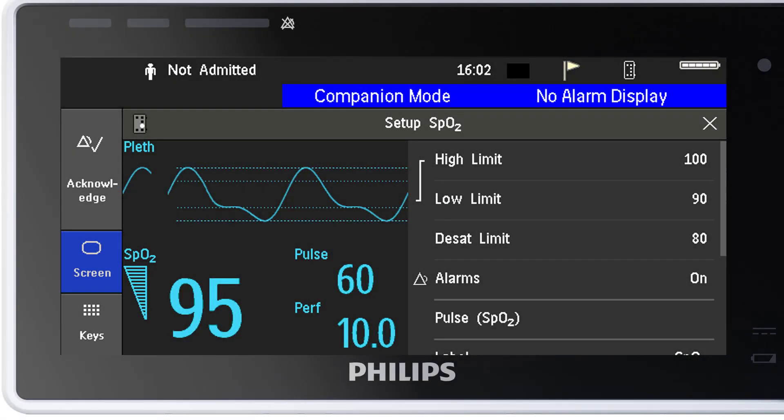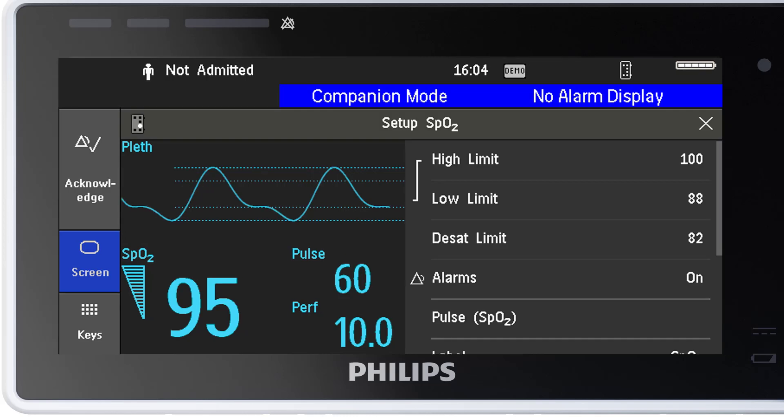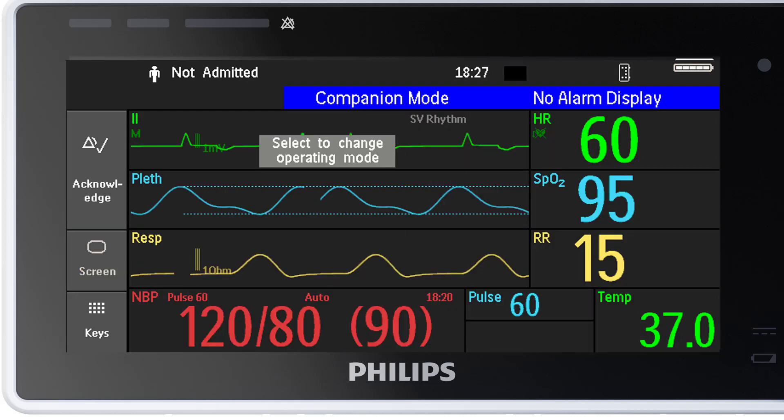Here you can see the SpO2 setup menu. In the menu, you can swipe down and up. I want to adjust the lower alarm limit to 88 and the threshold for the desaturation alarm to 82. I have now selected the new alarm limits and I can close the menu — there is no need for an additional confirmation. If you want to learn more about alarms in our Intelliview patient monitors, watch our microlearning about understanding alarms.